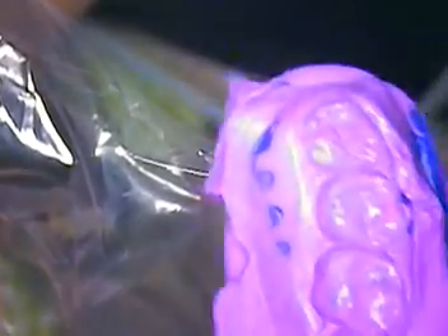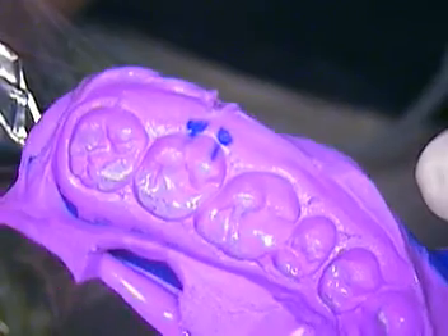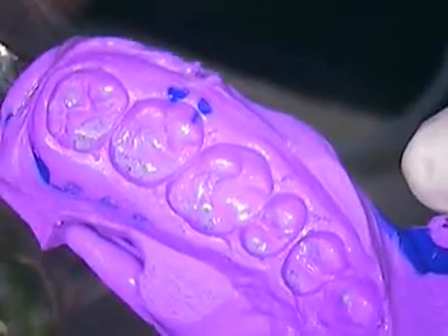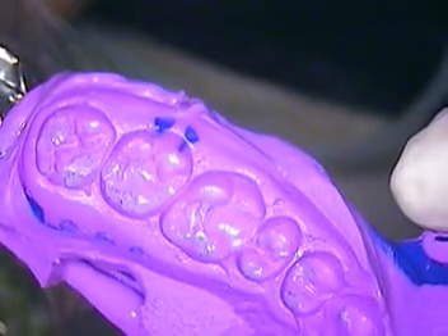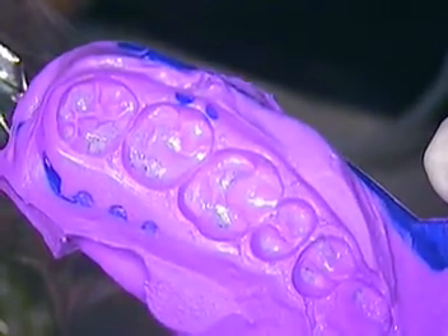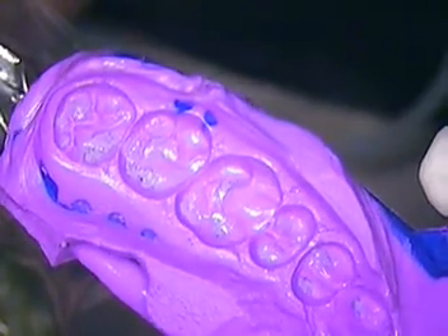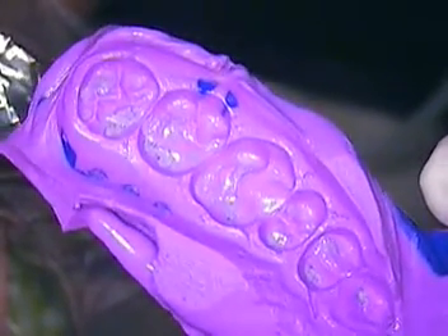Let me just explain: we're going to be on tooth number 14 today and we've gone ahead and taken a preliminary impression on tooth number 14. Olick presents with a situation where we had a root canal done on a tooth where the nerve was involved, so now the tooth is systemically and symptom-free. We're going to do a nice crown preparation for this tooth and give him parallel walls and good retention for not only his temporary but for his final prosthesis. We've already anesthetized him, and we're ready to go.